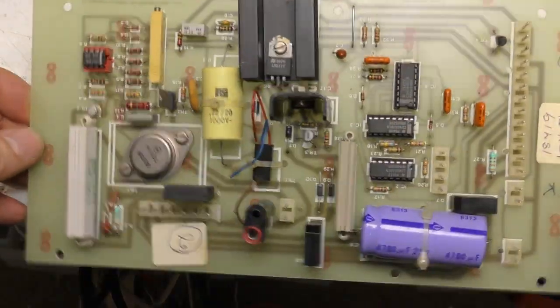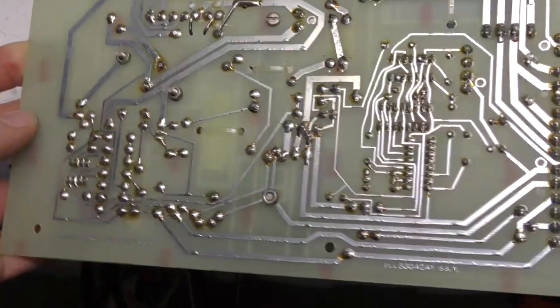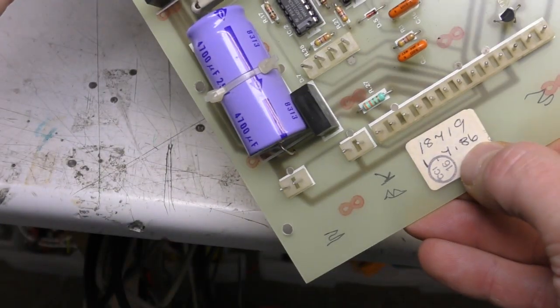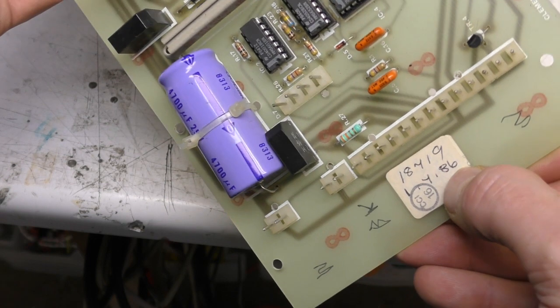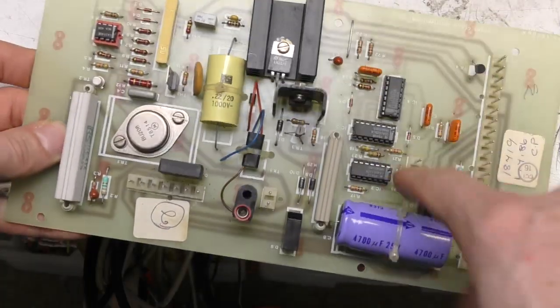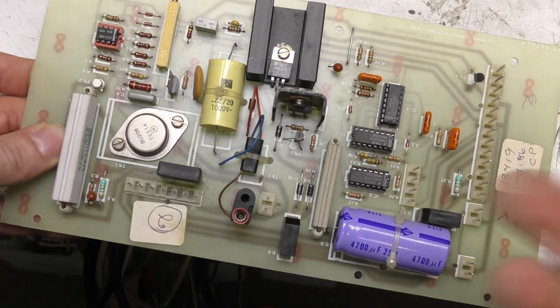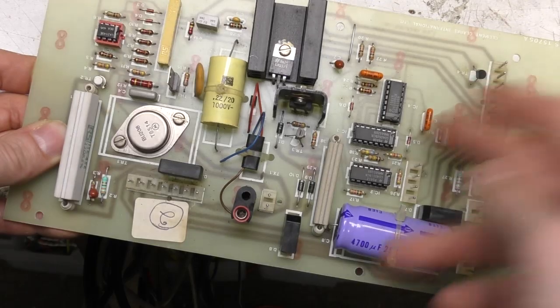So this is the PCB, a fairly traditional single-sided hand taped layout. It's dated 1986, but I suspect the design goes back quite a lot further than that. And some 4000 CMOS here, I think this is probably just to do with the delayed flash mode, as far as I can tell.